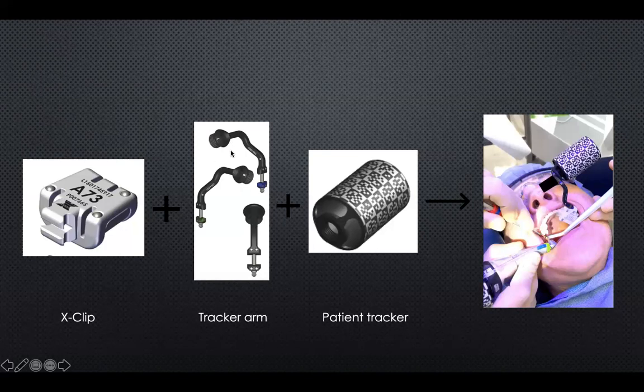And then you attach the tracker arm to the patient tracker. And after that, you place the whole assembly in the patient mouth. So it looks complicated, but it's not that complicated once you get familiar with it.